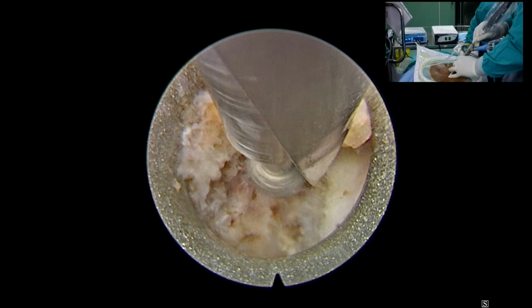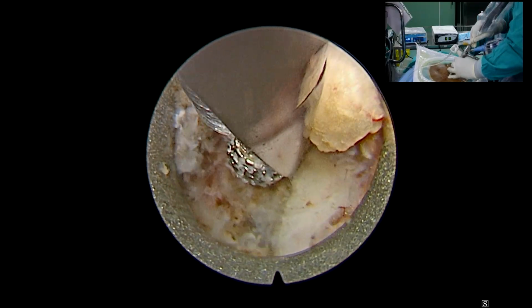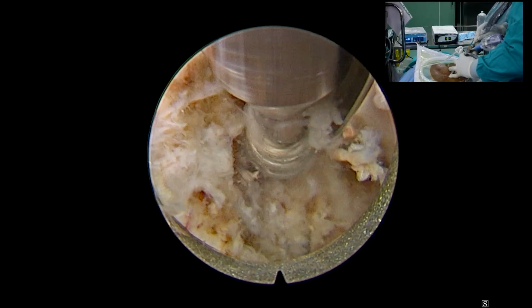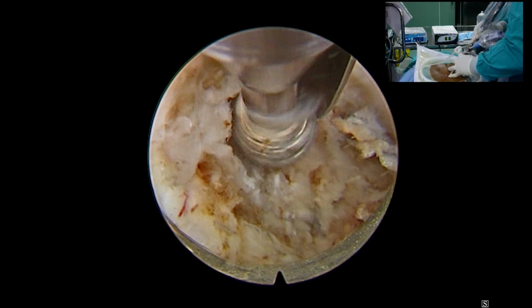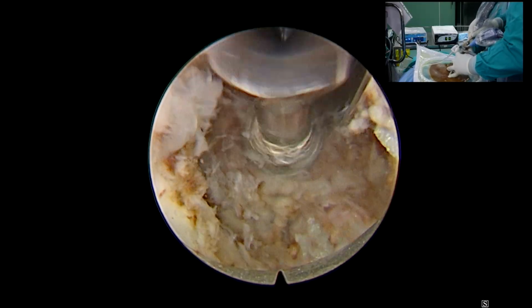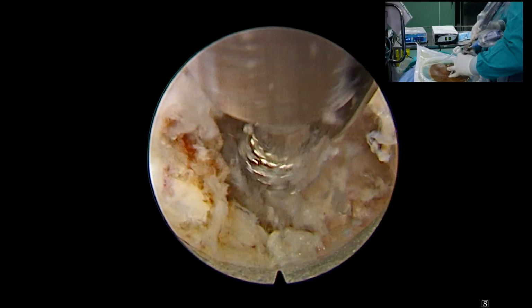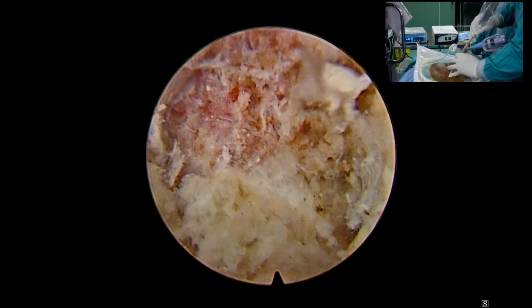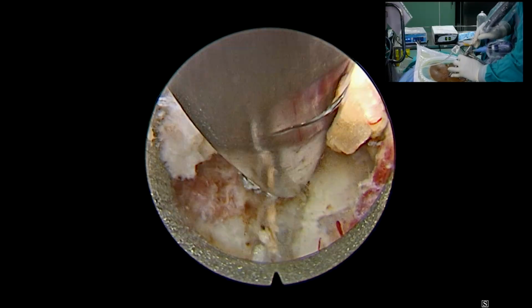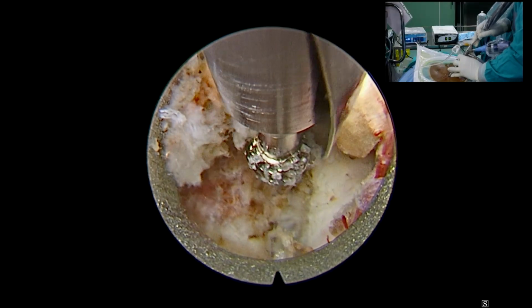No, this part is the flavum. This is the bone, which is where they're drilling with the burr. That's the bone, the lamina. But this burr particularly has one feature: even if you have to put it on the flavum and even if you drill it, it won't drill any other structure apart from the bone. It turns the bone to dust.